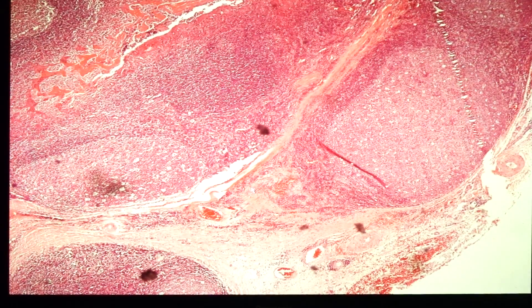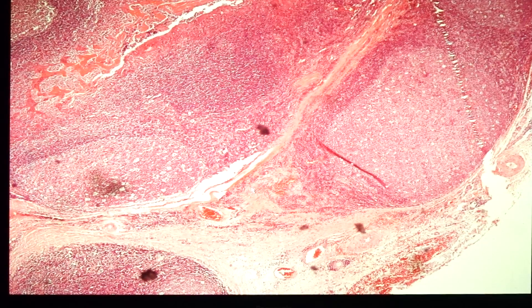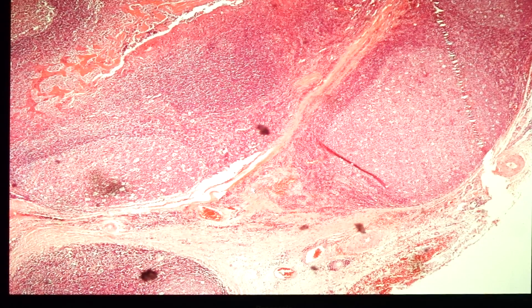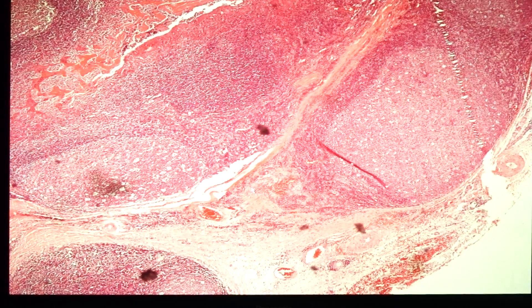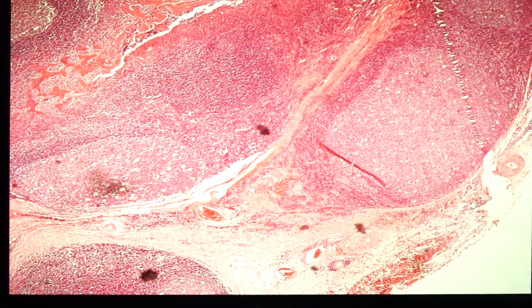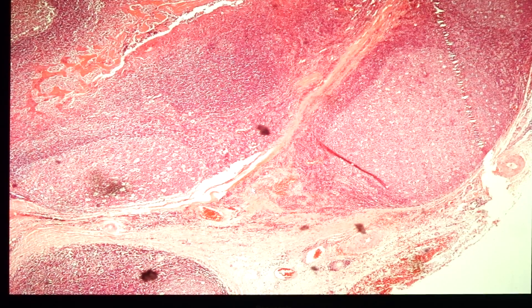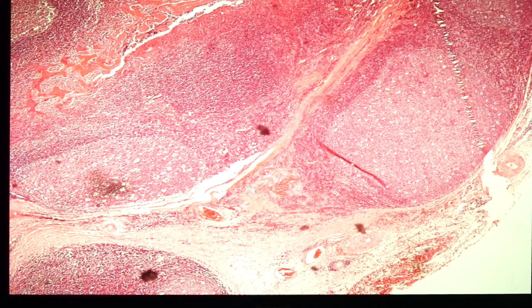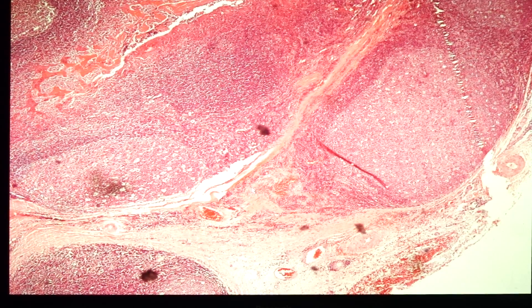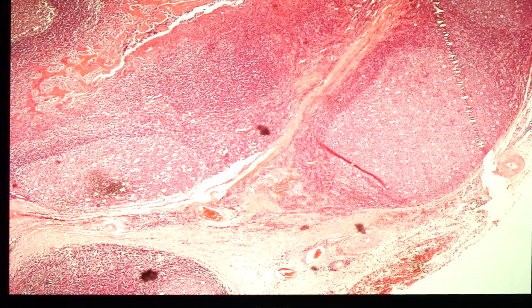Hi class, welcome to the online session. We are going to discuss today the white blood cell pathology. We have slide 67, reactive hyperplasia of the tonsil; slide 71, follicular hyperplasia; slide 50, sinus histiocytosis; and slide 93, plasmacytoma. So let us start with slide 67, which is follicular hyperplasia of the tonsil.